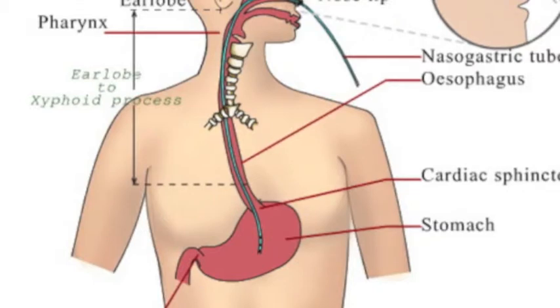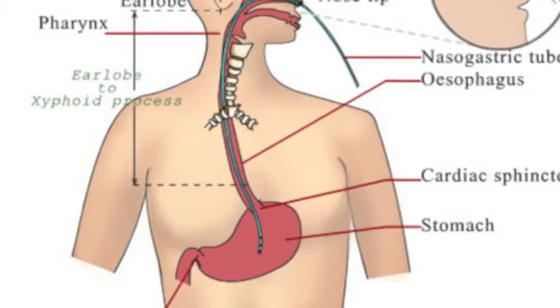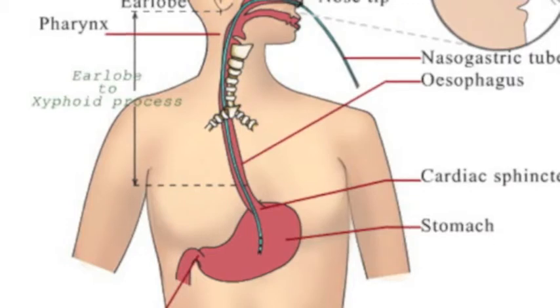I would tell him to tuck his chin to his chest, okay? But I will not tell him to swallow yet. So we would move it, and then you would put it in, as close as it's going to go. Then when I think it's hooked down back behind his nasopharynx. That's a real word, nasopharynx.